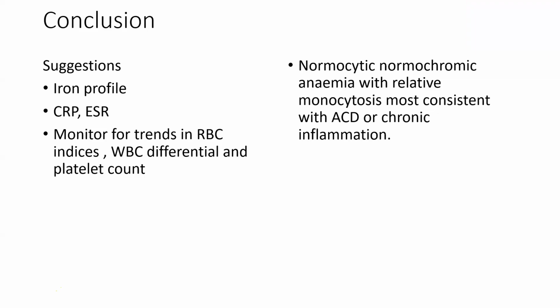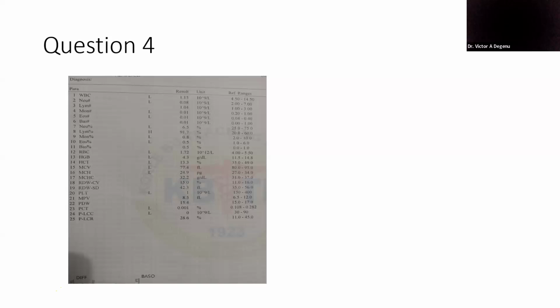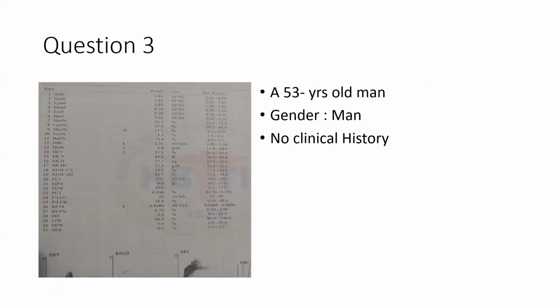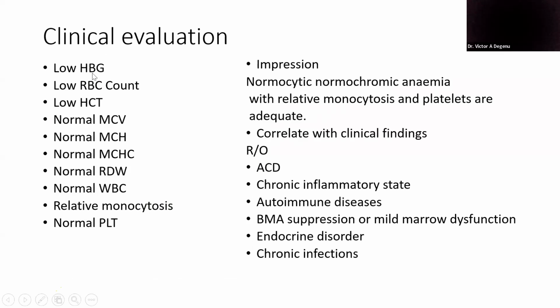So sorry, does that mean no matter the situation or the case, you have to suggest iron profile? Not so, because here we have low HB, low RBC, low PCV.